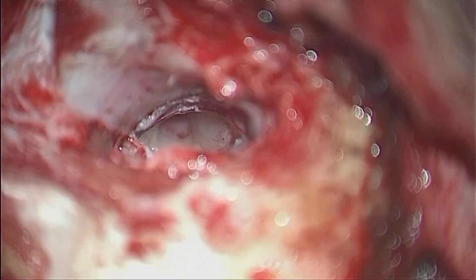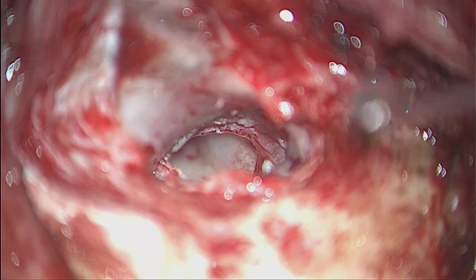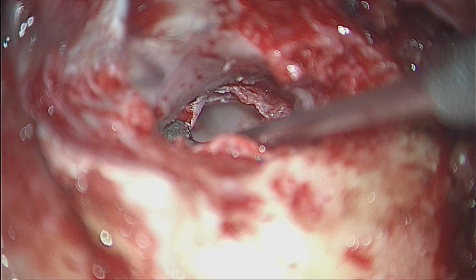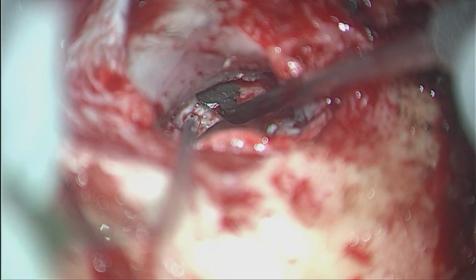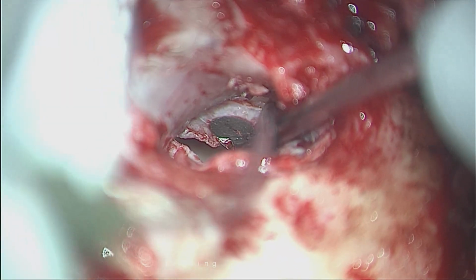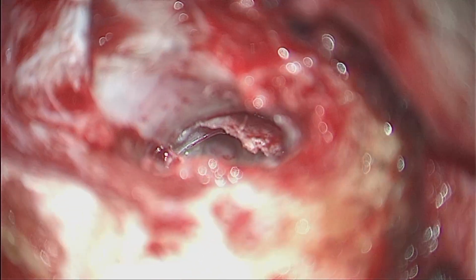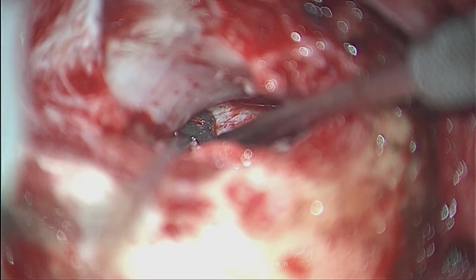So my next goal is to elevate this flap all around together till the level of the annulus simultaneously so as to avoid the tear. See, this anterior flap is thinner. You have to be a little bit more careful while elevating the anterior one. The posterior one is relatively thicker. Anterior one is sometimes a single layer of epithelium. You can see the glimpse of the annulus anteriorly. Very nicely. So this level of the annulus we have to reach everywhere simultaneously to avoid tears.